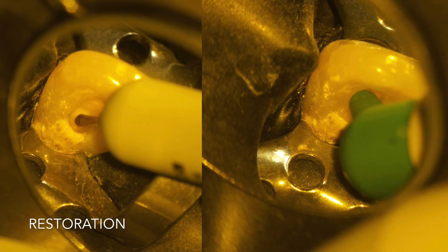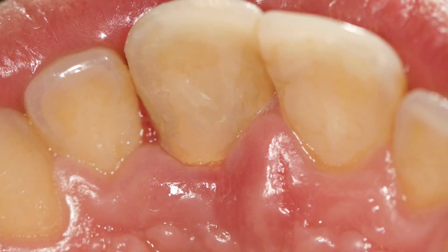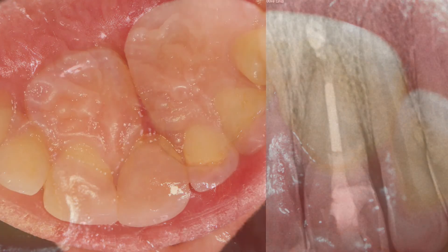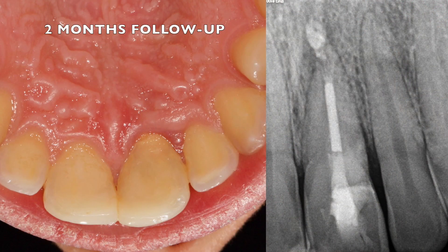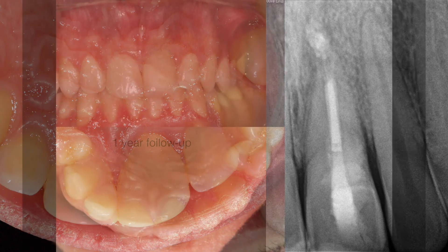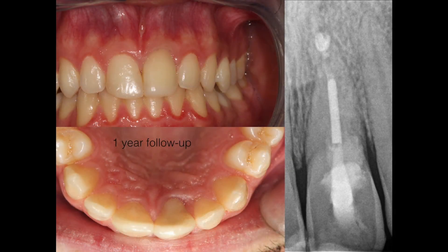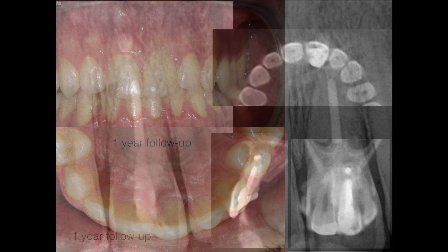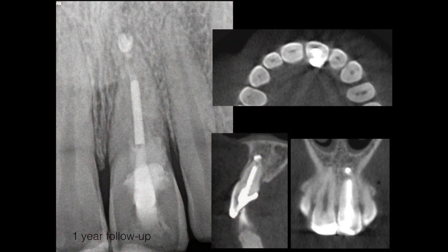We finished the case with an aesthetic restoration covering the Biodentine. After 2 months, the soft tissues were healed and the patient was doing well. At the 1-year recall, the patient was asymptomatic and the CBCT confirmed the lesion had healed.